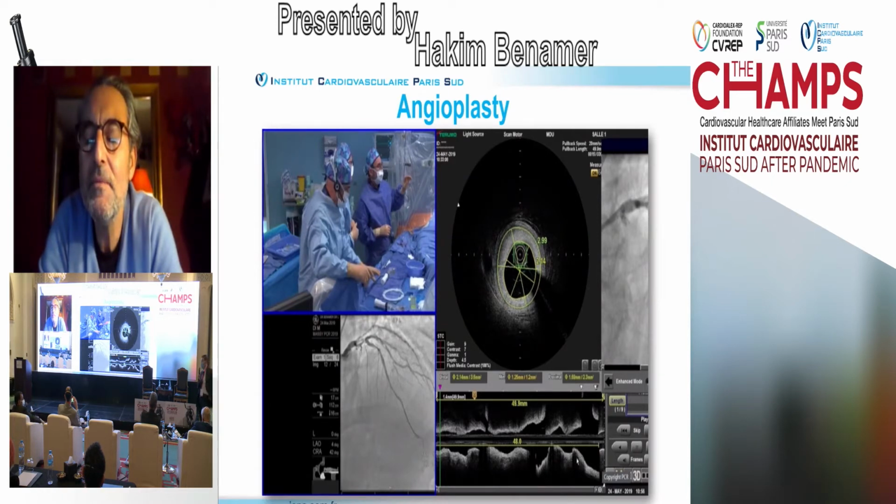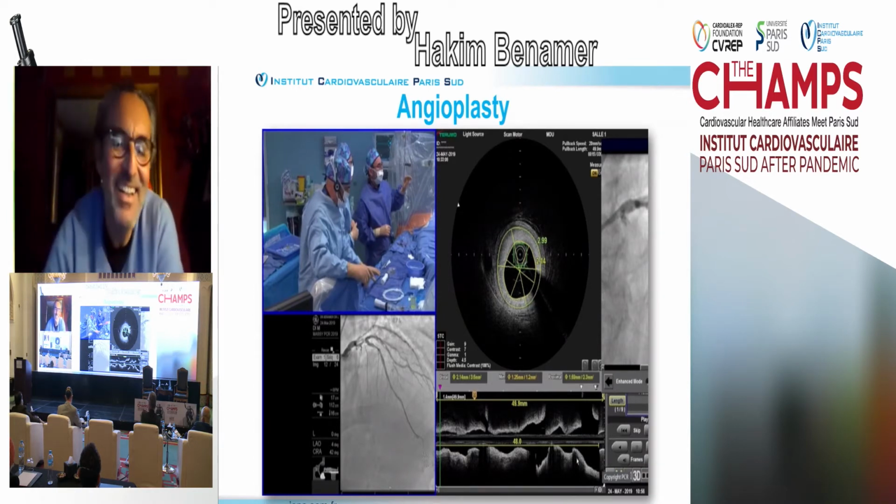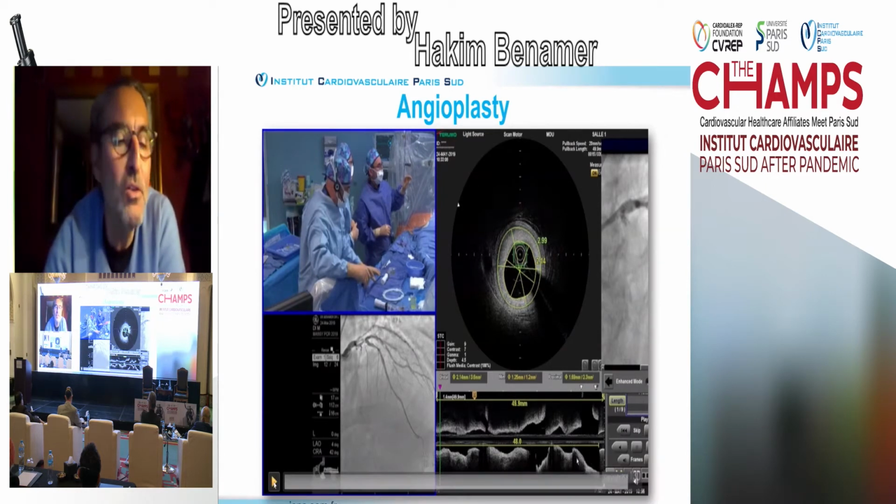So most of the panelists will go for crossover. Yes. Only one opinion here is with spot stenting. So let us see what you did, Hakim. Okay, so let's go on.